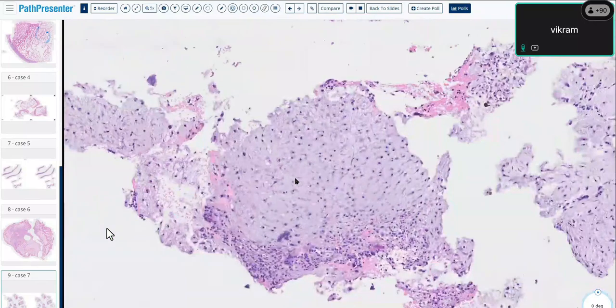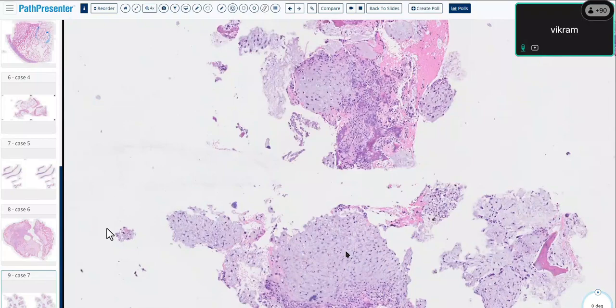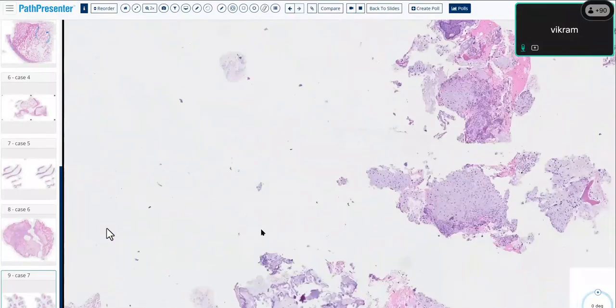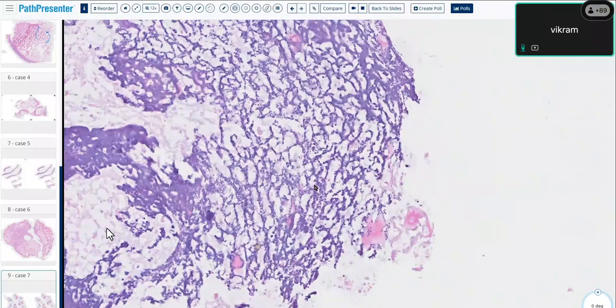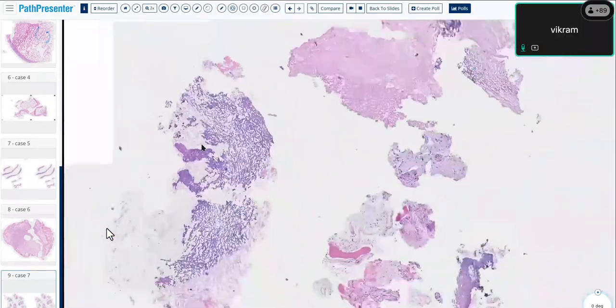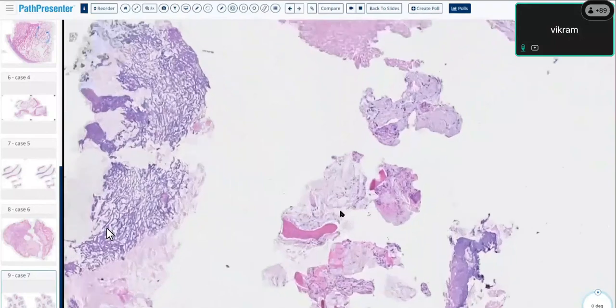Okay, so we have reached an enchondroma and a chondrosarcoma, so perhaps this chondrosarcoma arose in an enchondroma, right? Actually, a lot of chondrosarcomas arise in the background of a chondroma. But there's something even more interesting about this. What do you think is going on here? I know a lot of this is dying, but this chicken wire calcification, necrosis in the background, this is an osteosarcoma. So this is a dedifferentiated chondrosarcoma with osteosarcomatous differentiation.